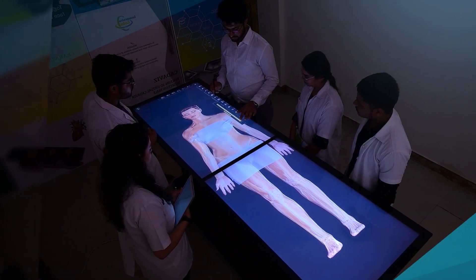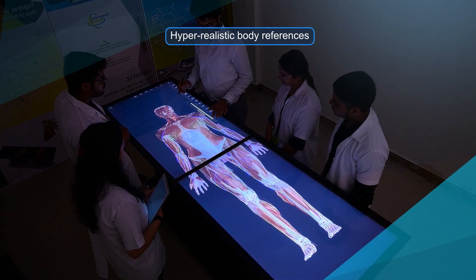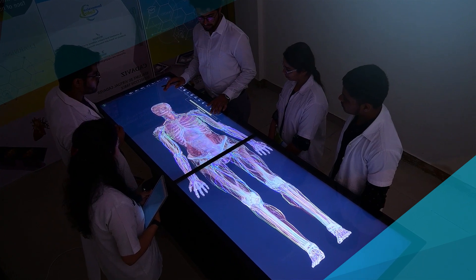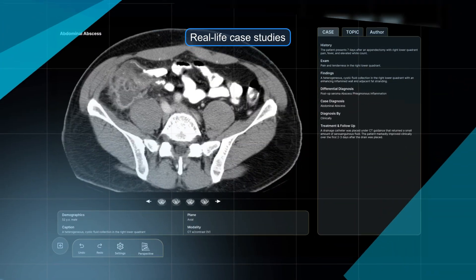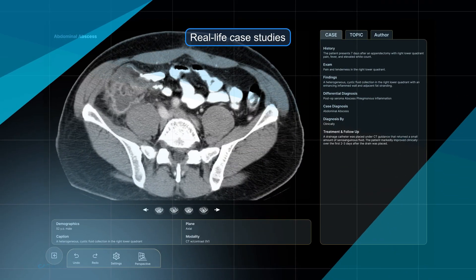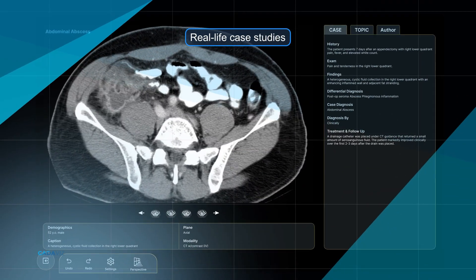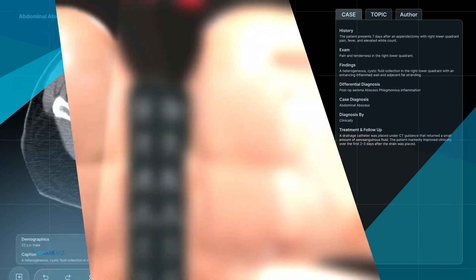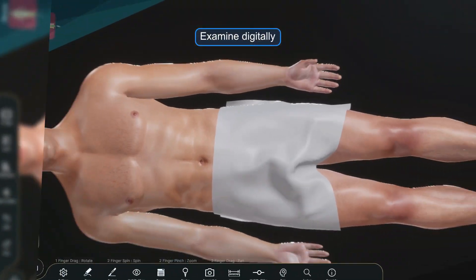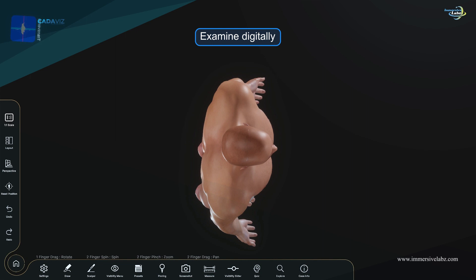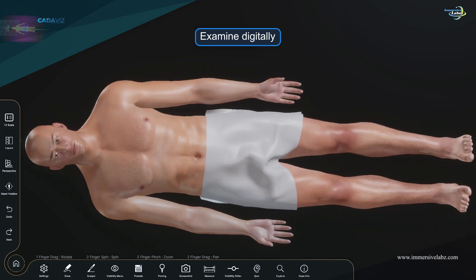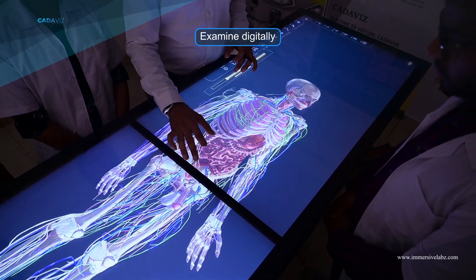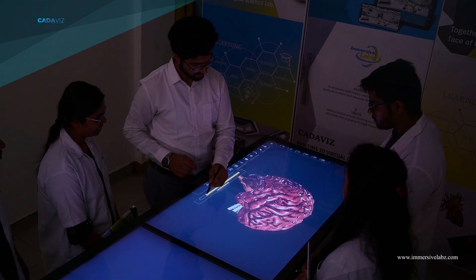Users can picture the anatomy as they would on a fresh cadaver. Easy understanding of histology with real-life clinical case studies. Users can digitally examine full-sized human bodies in a way that was previously only possible through conventional cadaver dissection.